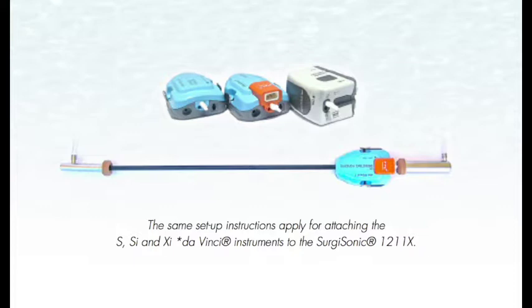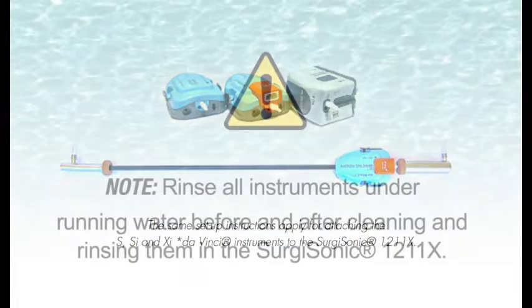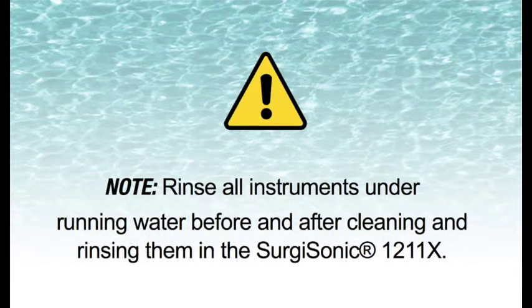Three DaVinci robotic instruments, including the S, SI, or XI, can be cleaned at the same time using this dual hookup method. Please note: rinse all instruments under running water before and after cleaning and rinsing them in the Surgisonic 1211X.